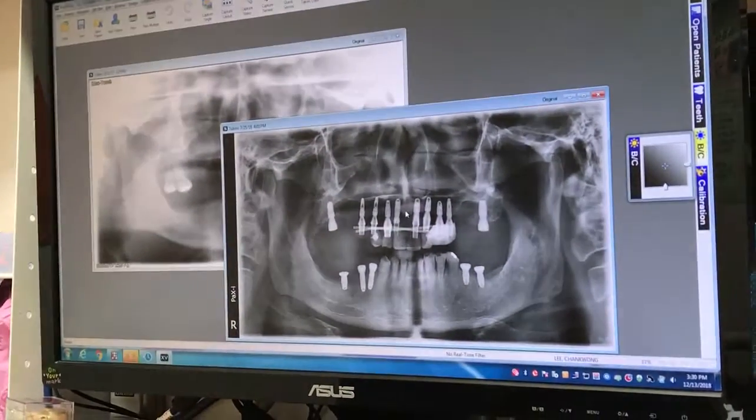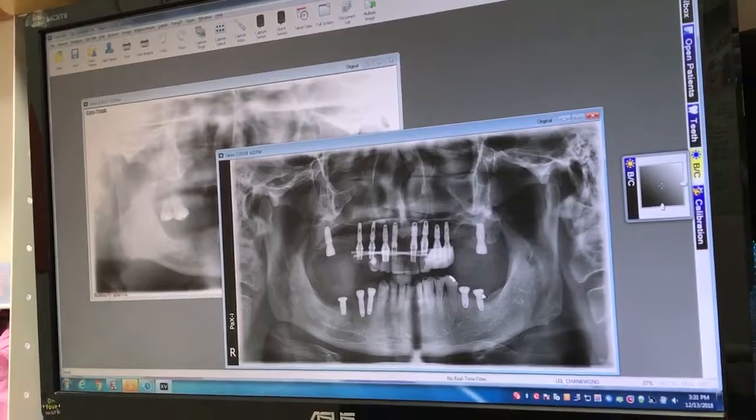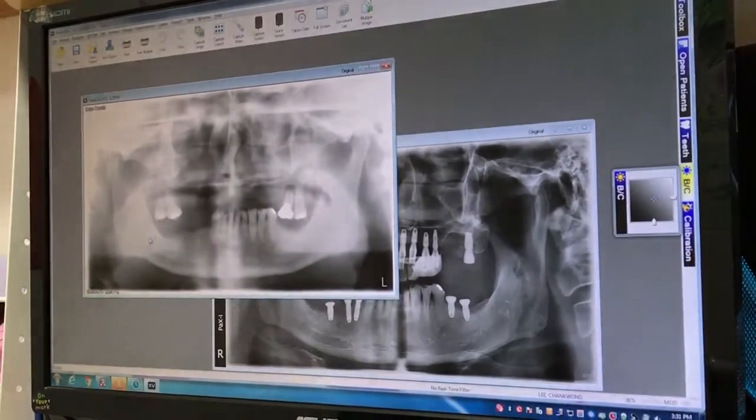We were able to place ten implants on the top and five implants on the bottom. Today we are just inserting the top.